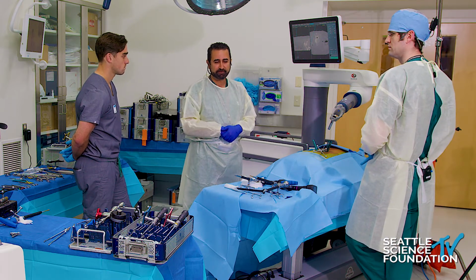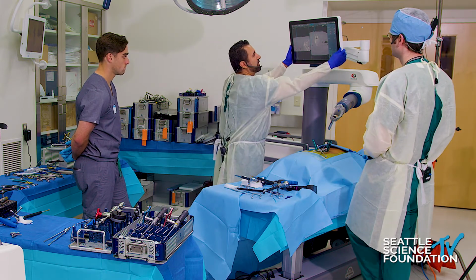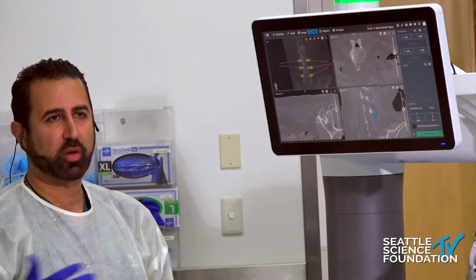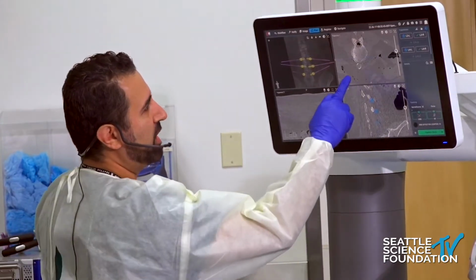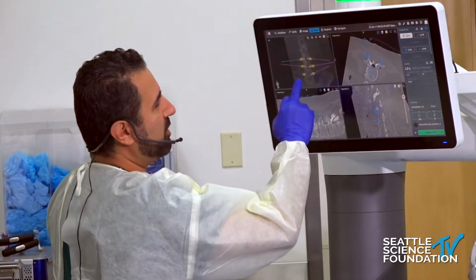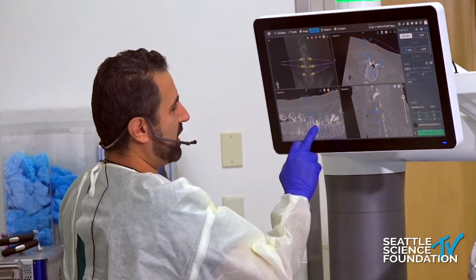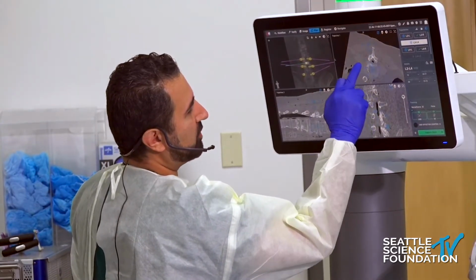Great. Okay, any other concluding statements? Yeah, just one last thing, Jens. When it comes to interbodies, we talk about where the robot is going, and I'll talk about that. Here's one additional capacity that has developed over time. I'm able, for example, to take my interbody placement here in 3/4, and you can see this, and basically select that instrument and drop it down and place my interbody cage into the spot that I want.